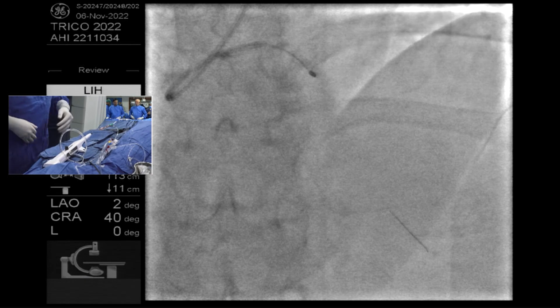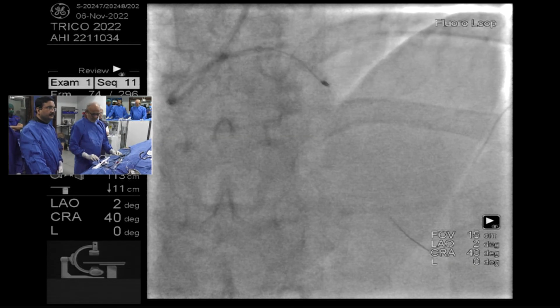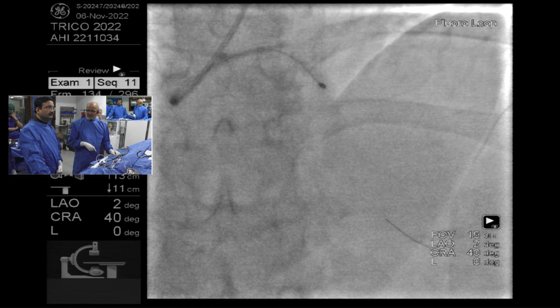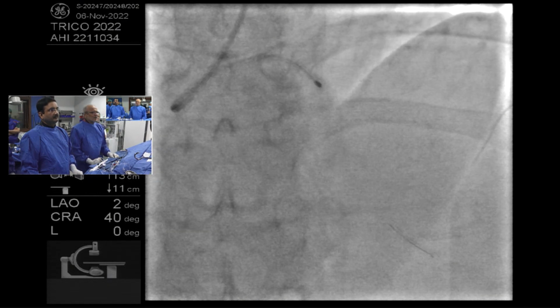See, it's too resistant. There is a lot of plaque there and it's not geometrically friendly. I anticipated this problem in this case. Absolutely. It is going to cut a lot of lumen, which is a good thing. It's going to be bigger than 1.5 when you're done.